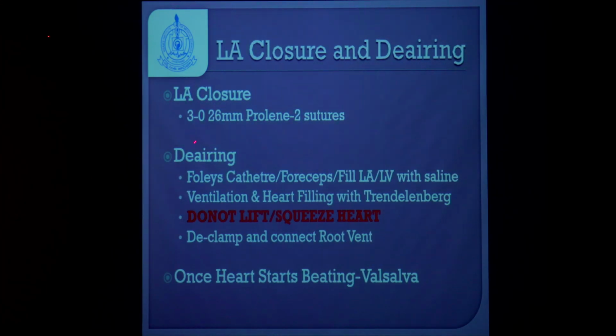LA closure is done using a 3-0 polypropylene suture with a 26 mm needle, and we generally use two sutures. We have to see to it that both the edges of the LA are properly incorporated and under vision, and even the endothelium of the LA is taken.